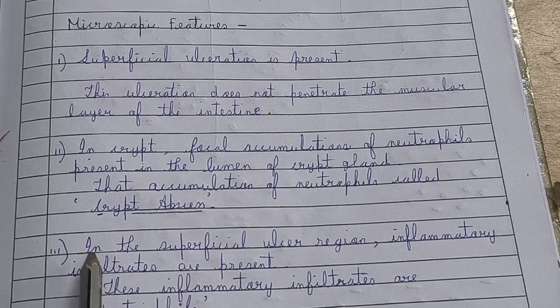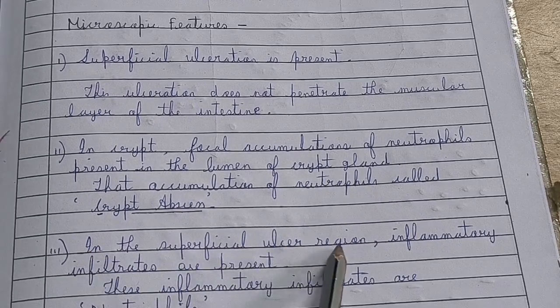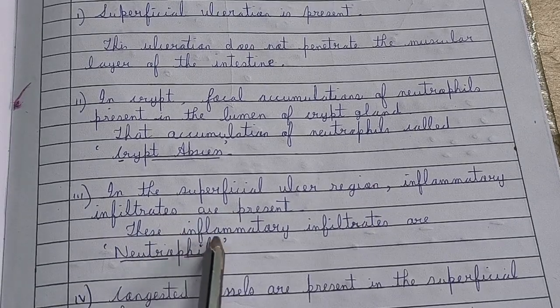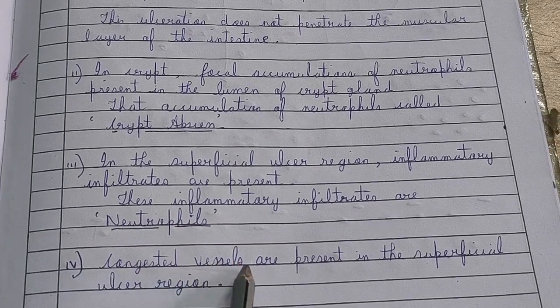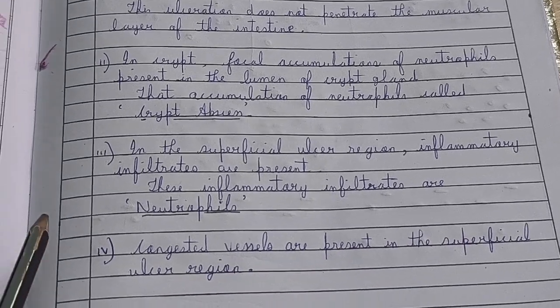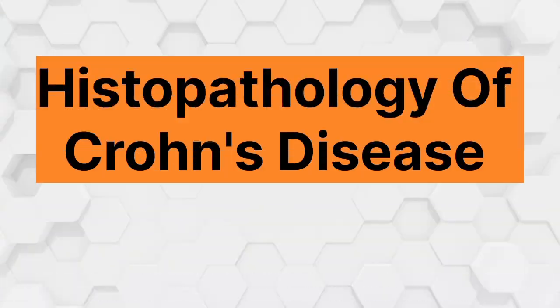And third, see that in the superficial ulcer region, inflammatory infiltrates are present, and these inflammatory infiltrates are neutrophils. And the fourth thing is that congested vessels are also present in the superficial ulcer region. That's all about the microscopic or histopathological features of ulcerative colitis.